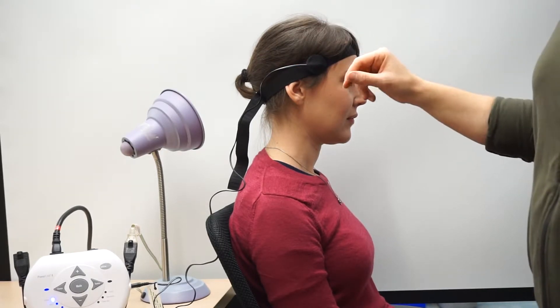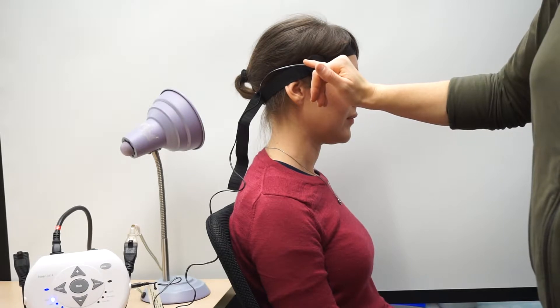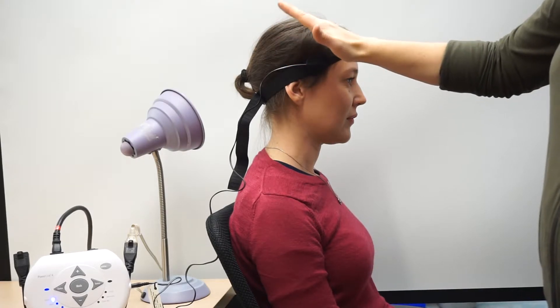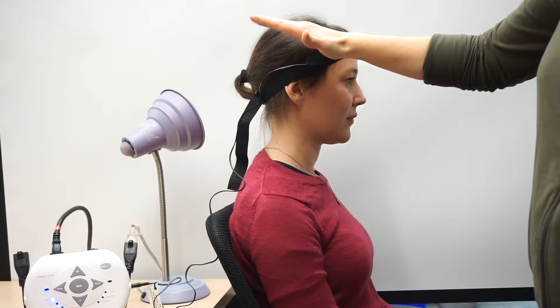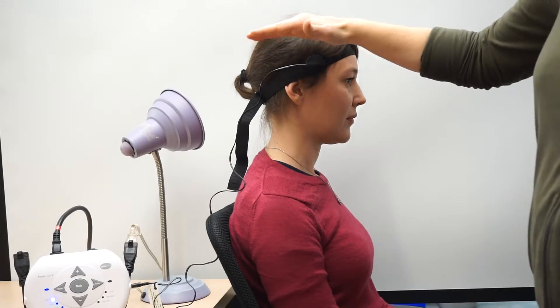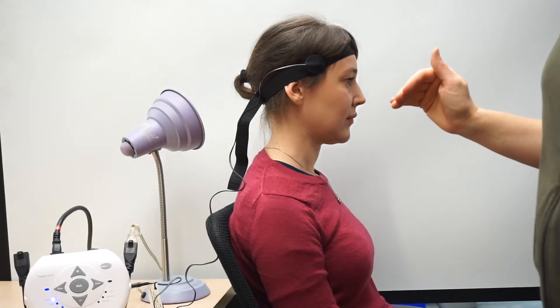A Tilt Switch is activated when a small ball of mercury falls back and connects the contacts on that wire. When setting up the Tilt Switch, it's important to have this wire either above or parallel with the floor to prevent the mercury from being activated unless you want the switch to always be on. We have it set up so that in the neutral position the switch is not activated.